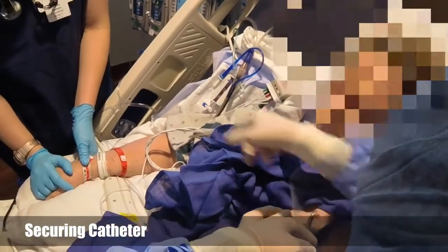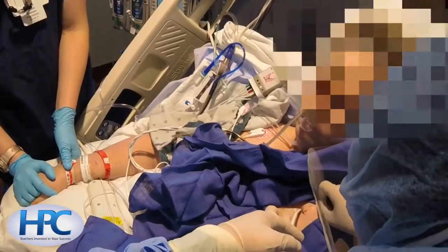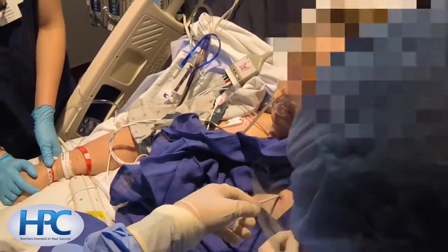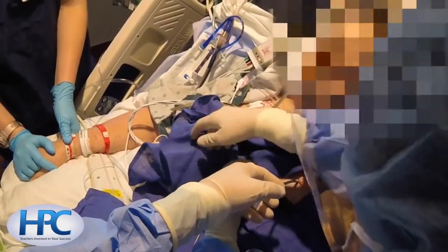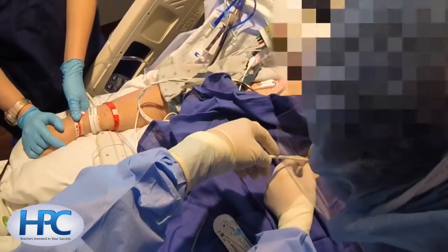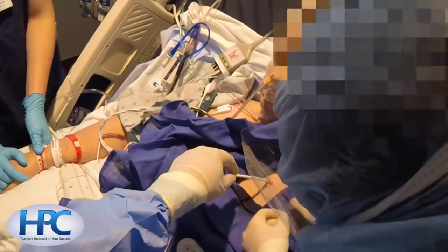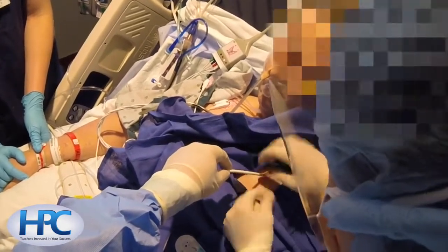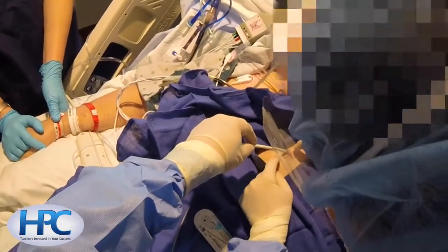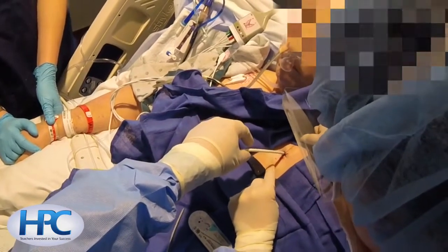And now the suture is wrapped sequentially around the catheter so that we can tie a firm suture knot on the catheter. It's important to have a firm knot on the catheter, but that the knot is not too tight as to kink the pigtail catheter.